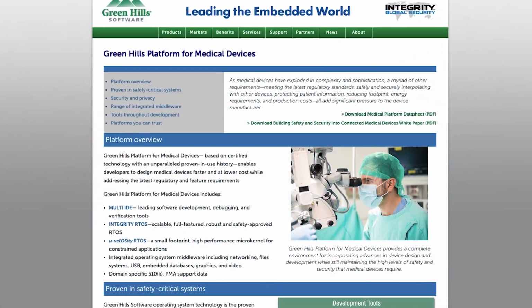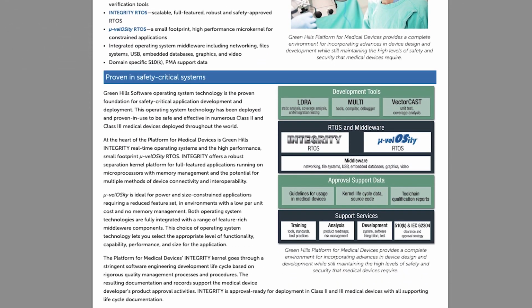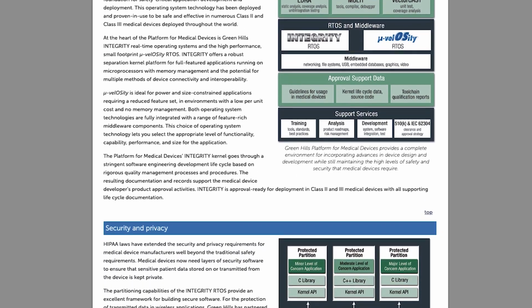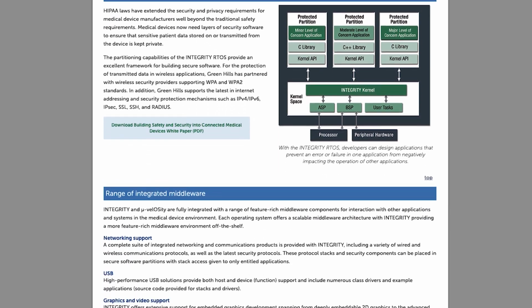And when you're talking about life critical systems, you need to make sure that those critical systems are immune to cyber attacks. So what are some of the things that you can do to prevent it? When you're talking about designing the systems, you need to make sure that you have an operating system that has achieved a level of rigor that does not have any holes in it, such as critical vulnerabilities. So like off-the-shelf Windows or Linux, that's not going to work for you.